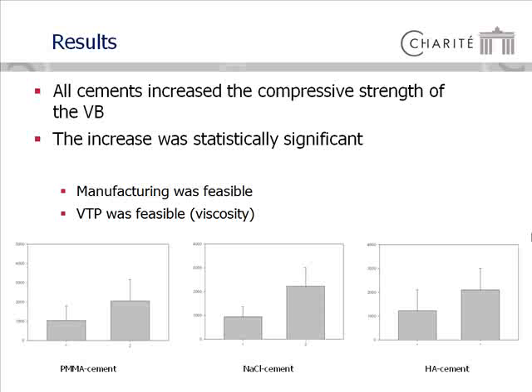Manufacturing, as a secondary key endpoint, was feasible. The mixing was not an issue, and the application through a conventional vertebroplasty needle was not a problem as well. So what can we conclude?